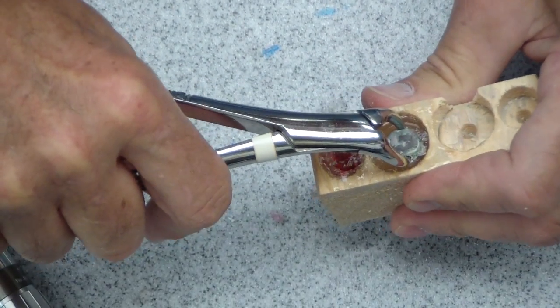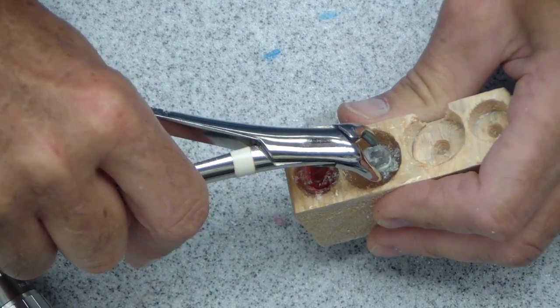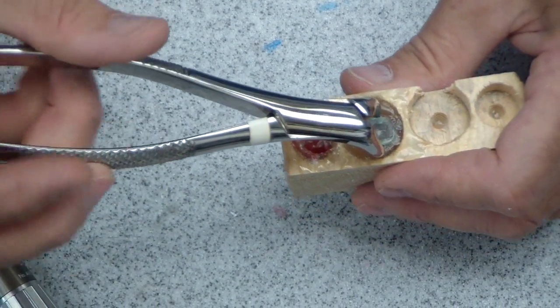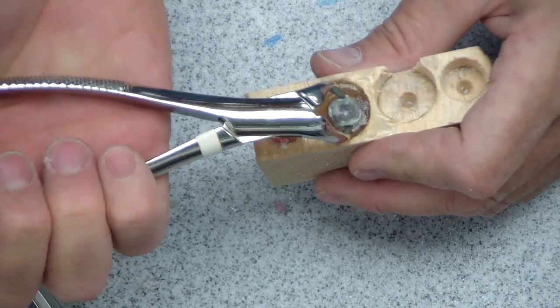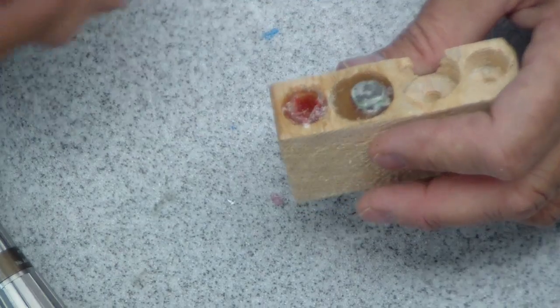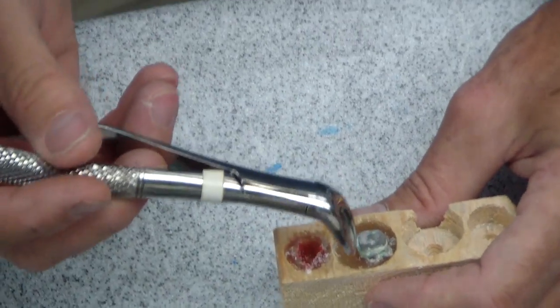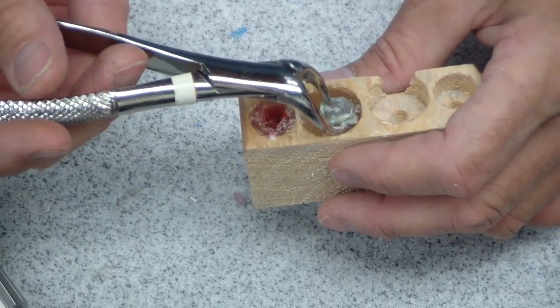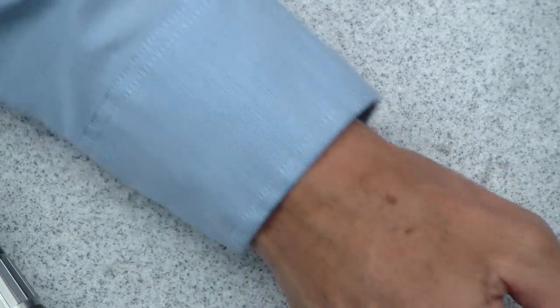Once you get a grip on it, it's mine. What does happen, especially in endo-treated teeth, a lot of times when you do that, you'll break it right in half, and that's not a bad thing either because then you can elevate one half of the tooth against the other. In fact, a lot of times that's what I'll do. You've got a lot of alternatives to taking those teeth out if that doesn't work right off the bat.